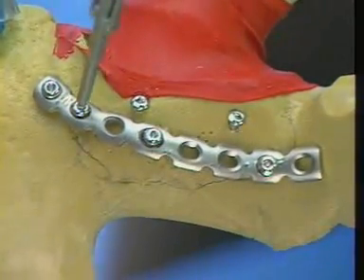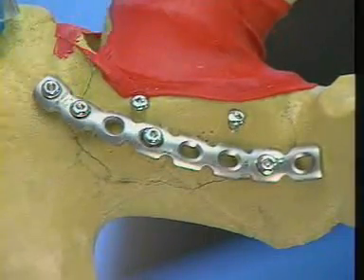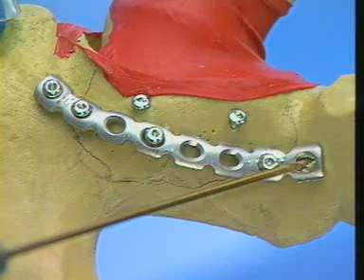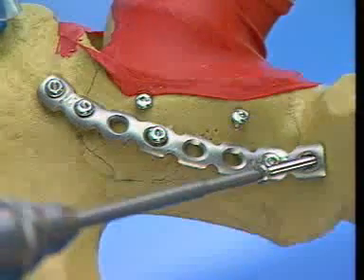Another screw at the upper end of the plate is inserted. A final screw is directed distally into the ischium.